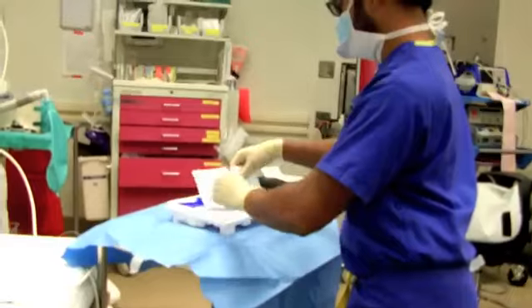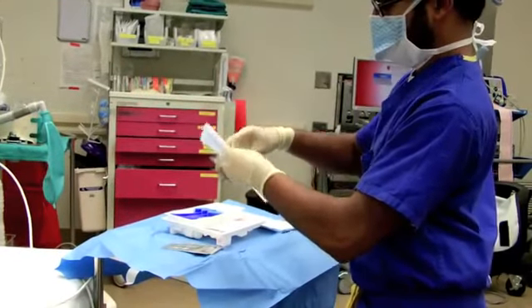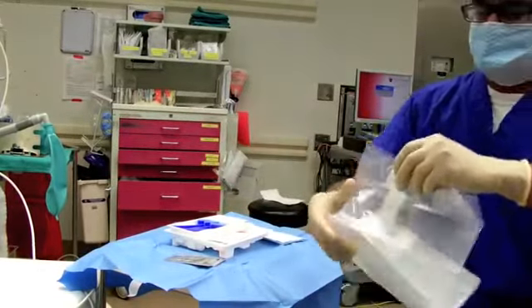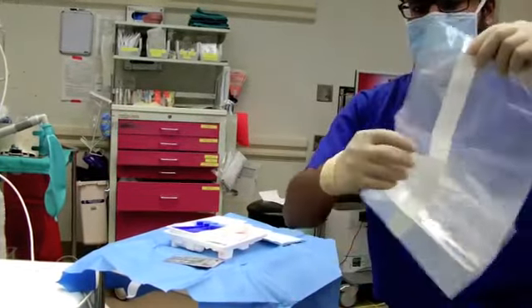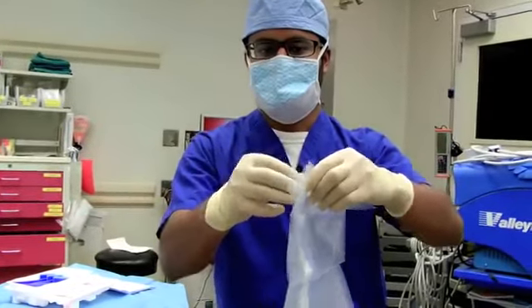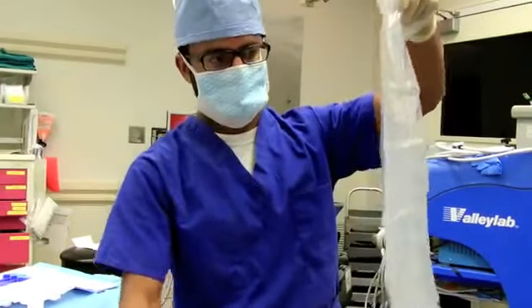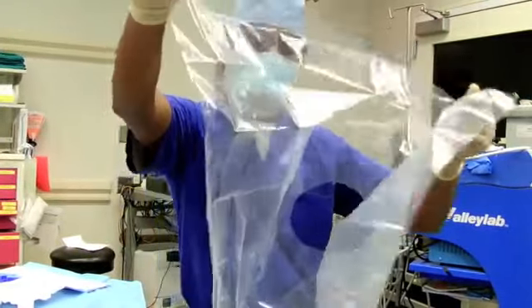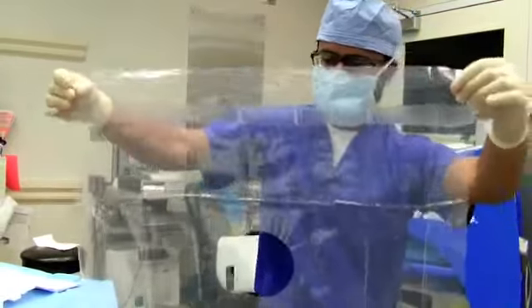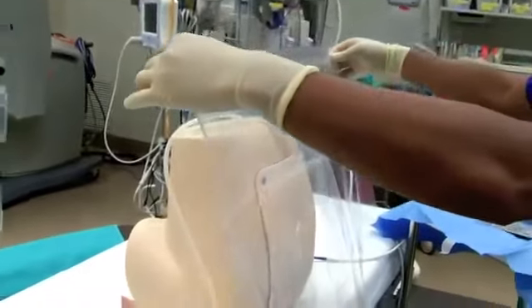In the spinal kit, I'll locate the sterile drape, making sure to not have it touch anything else. Remove the sticker. Open it and apply it to the patient so that the window is where I marked the initial skin.